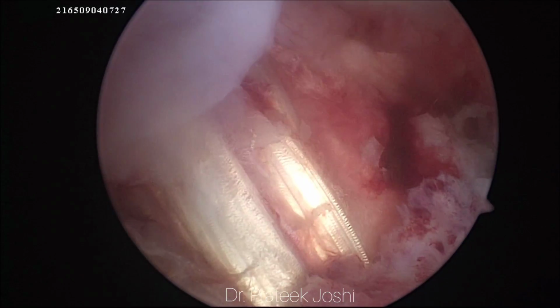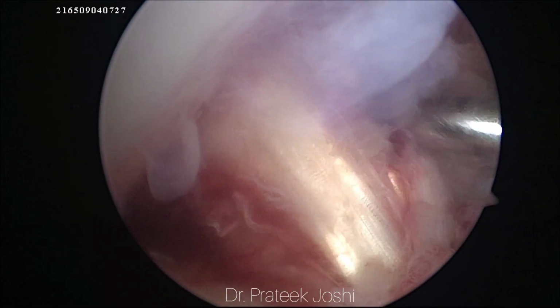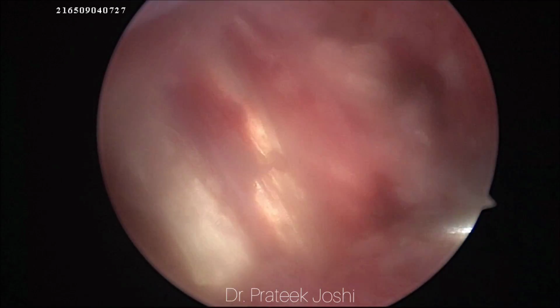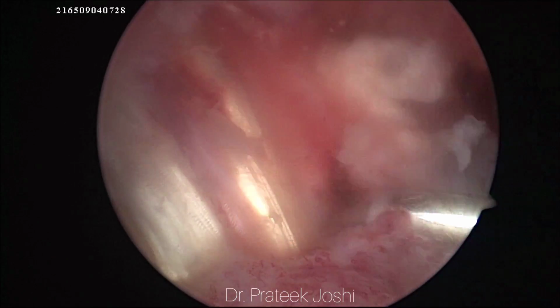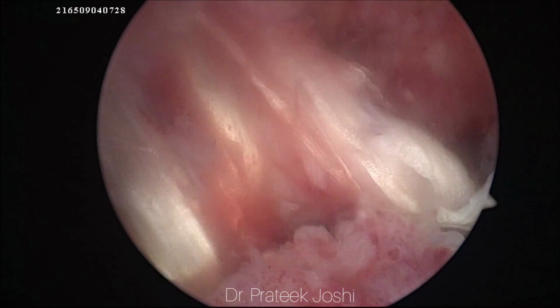This is the final picture of our graft as seen through the anterolateral portal. You can see it is in the anatomical position. It has good tension. This is going to give good rotational stability as well as anteroposterior stability to this patient's knee joint. This completes the procedure.